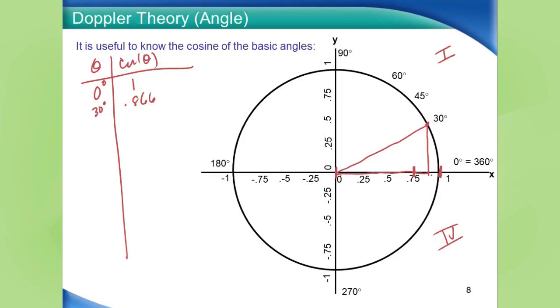That value should make some sense to you. Now, we're going to rotate up to 45 degrees and drop it down. What you see is the cosine's just a little bit less than 0.75. The actual answer is 0.707. And now we're going to rotate to 60 degrees. And anyone who's done any vascular, as soon as they say 60 degrees, should start to shake uncontrollably.